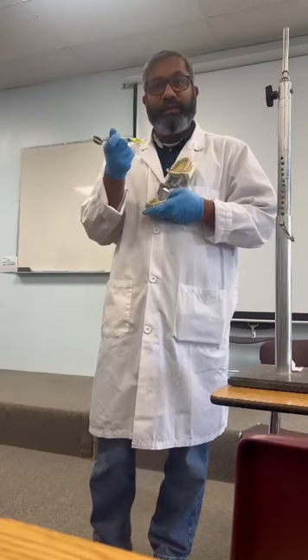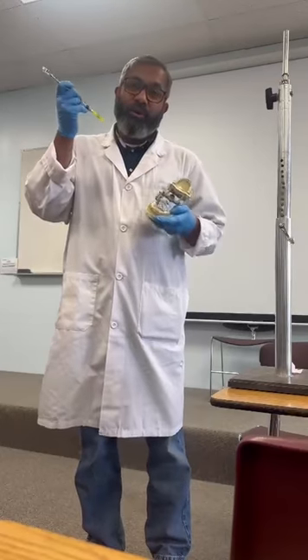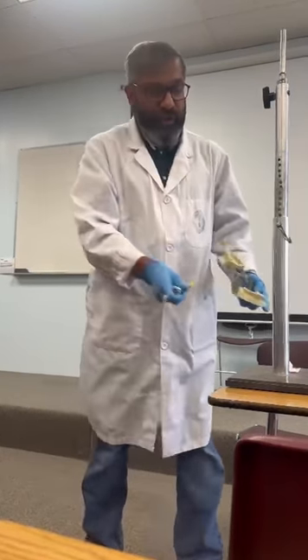But that is one of the very tricky injections, because we have to go all the way inside. Here we have a bone called the ramus. The vertical part is the ramus, and then we have the body of the mandible. In the middle of the ramus, there is a small bony projection inside, not outside. That is called the lingula. The lingula acts as a guard, so the nerve is coming like this, and we have to give the injection here.